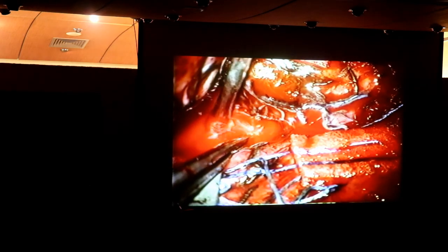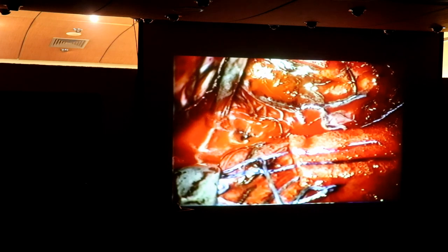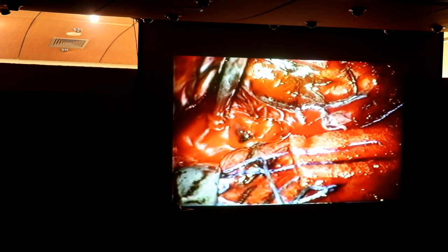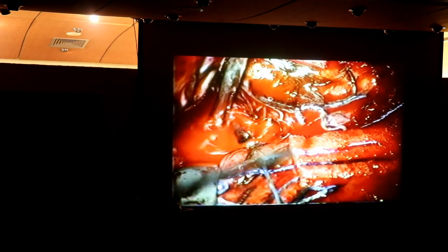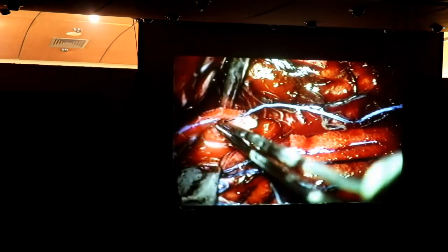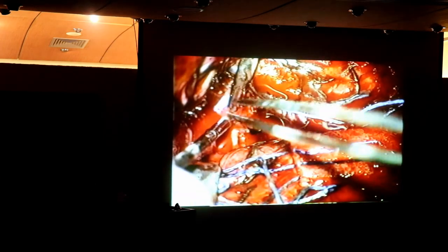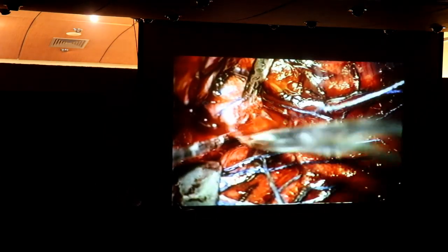So how much blood did you end up giving him? It's not major blood loss, it is the blood obscuring your vision. You may bleed from your radial artery more than this one. But a radial artery you can see, this you don't see. For a radial artery, you can put an artery clip on it, here you can't.